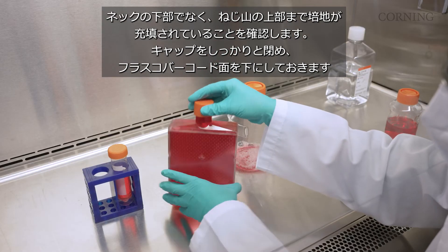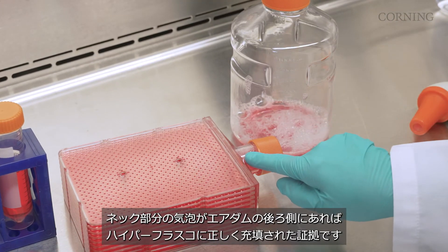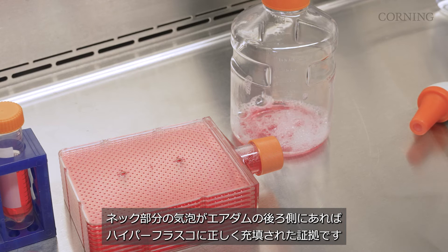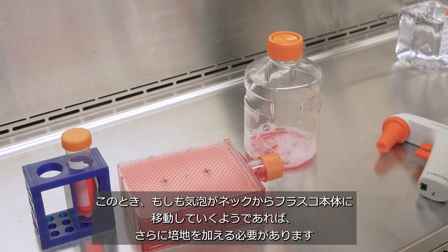Tightly cap the vessel and lay it flat, barcode down. As long as the bubbles in the neck are located behind the air dam, you've properly filled the hyperflask vessel. If bubbles do travel into the body of the vessel, you'll need to add more media.